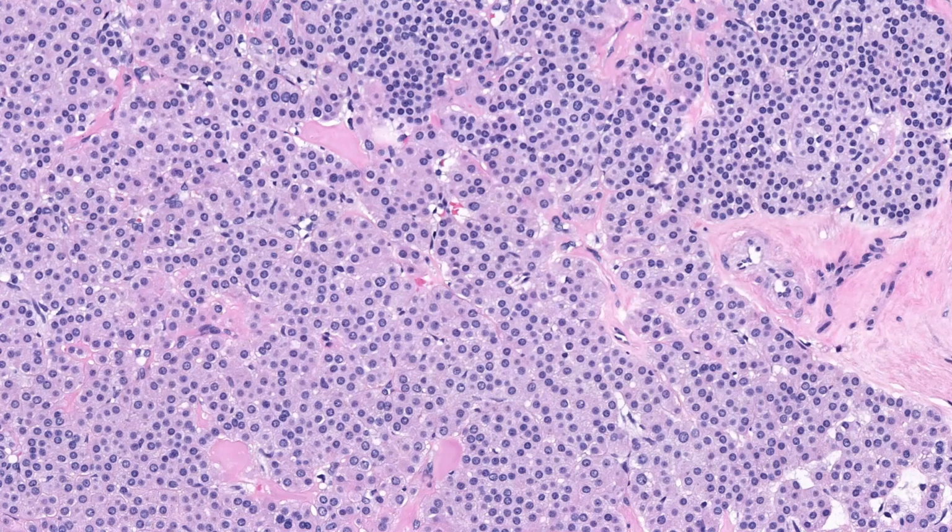Glomangioma, the second most common subtype, makes up about 20% of cases. Glomus cells are still a significant portion of the tumor, but there are also numerous large, dilated vessels. The third and final subtype, glomangiomioma, is very rare. It looks similar to glomangioma, but with the addition of a distinct smooth muscle component.